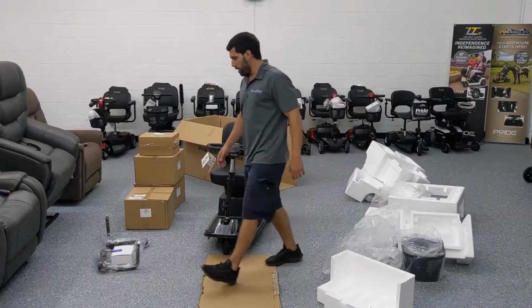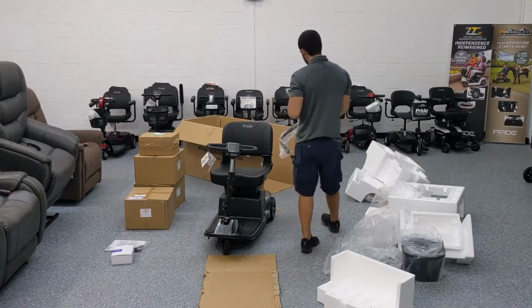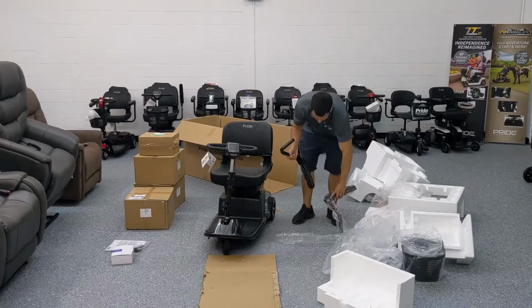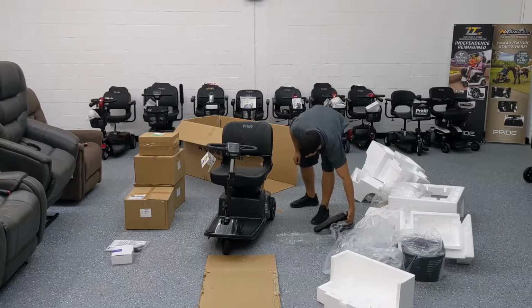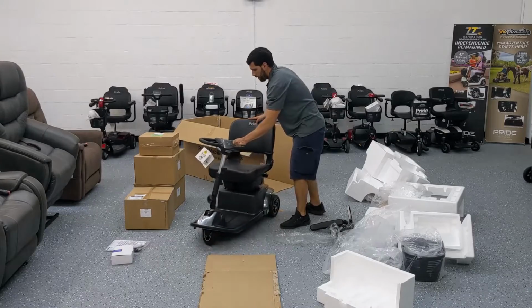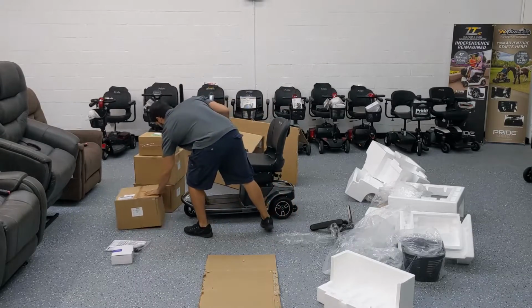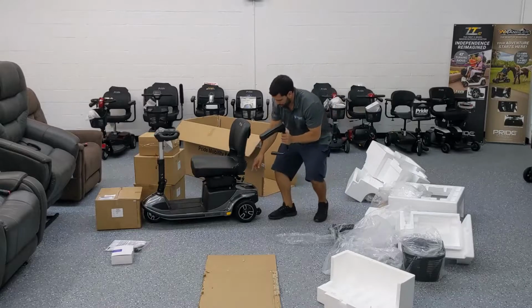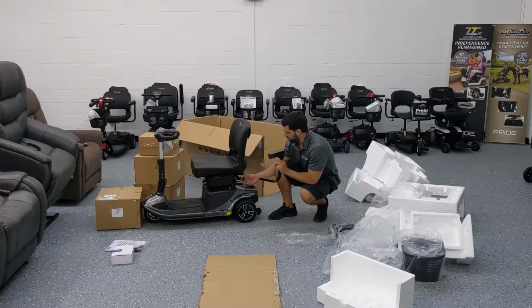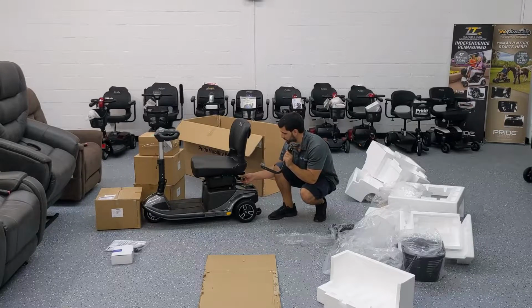The next step would be to get the armrests that we took out earlier. I put them off to the side right here. I'm going to take each one of these armrests, take the plastic right off, and start connecting them. Putting the armrest in is super easy. In fact, I'm going to go ahead and turn the scooter to the side for a second. So you can see on the sides of the chair, there's a slot here. It's got a little tightener here, which you can loosen all the way. It's just a little knob that's used to hold the armrest in place, and there's also a pin that comes out.